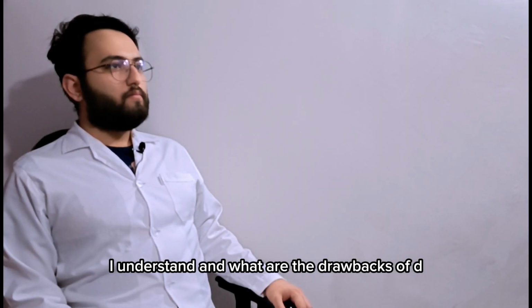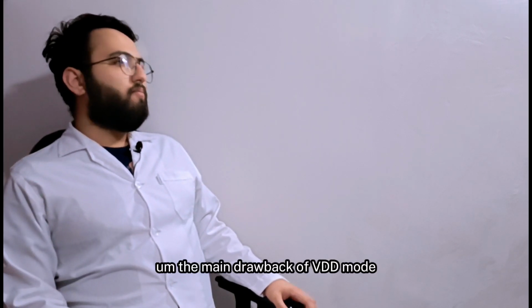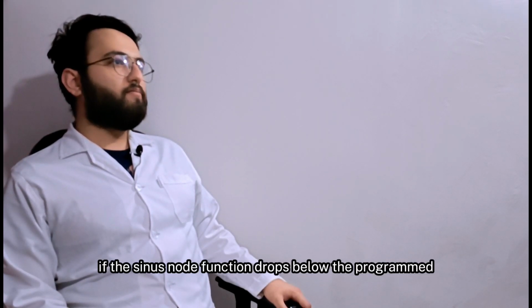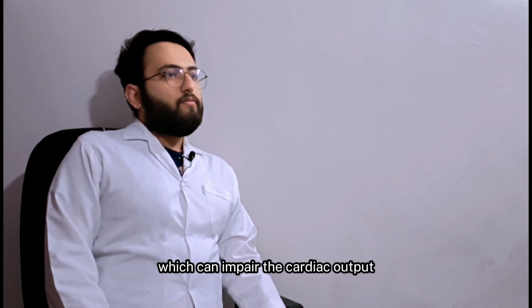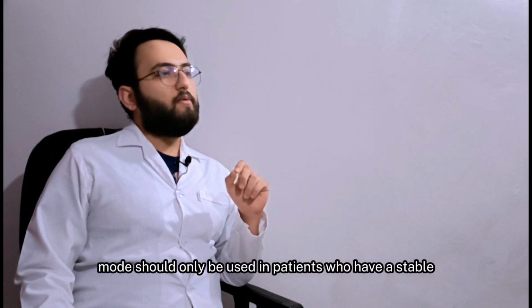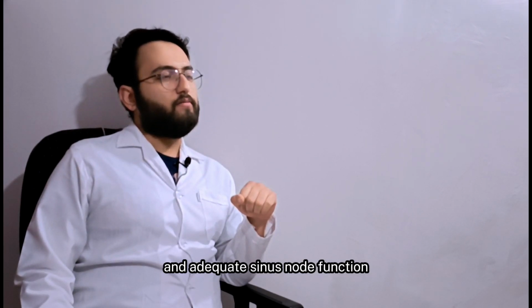I understand. And what are the drawbacks of VDD mode? The main drawback of VDD mode is that it can cause AV dissociation if the sinus node function drops below the programmed low rate of the pacemaker. This means that the atrium and ventricle will beat at different rates, which can impair the cardiac output and cause symptoms such as dizziness, fatigue, or shortness of breath. Therefore, VDD mode should only be used in patients who have a stable and adequate sinus node function.